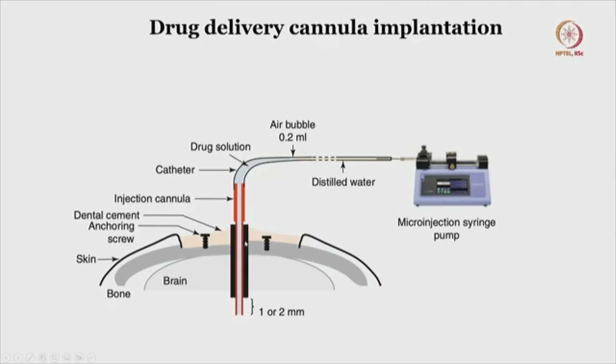The guide tube is something which has been implanted using the stereotactic coordinates. Once the stereotactic apparatus is out, you can use this particular cannula anytime without the stereotactic setup, by using the guide tube, which is going to maintain the coordinates that you have used, and this guide tube has been fixed rigidly to the skull using the dental cement and the screws. And this is the idea even for the optogenetic cannula we just discussed, and for that matter microelectrode implantation.